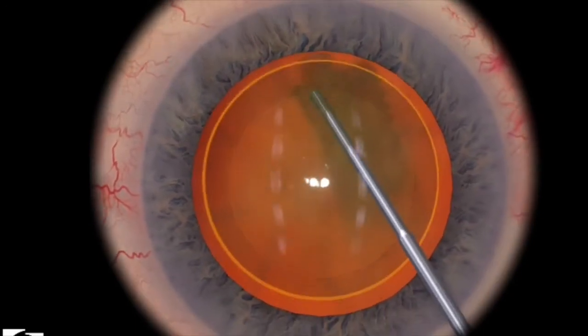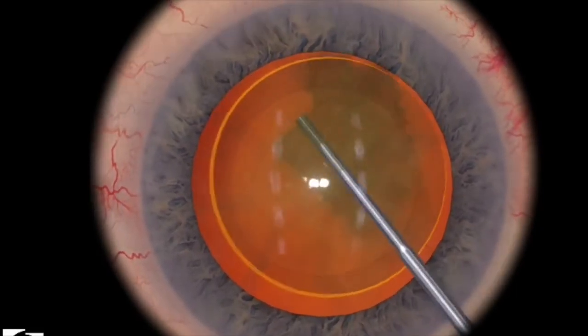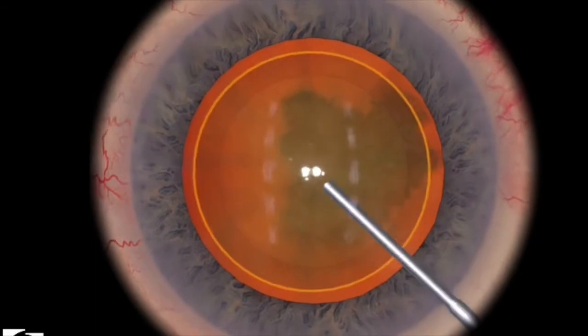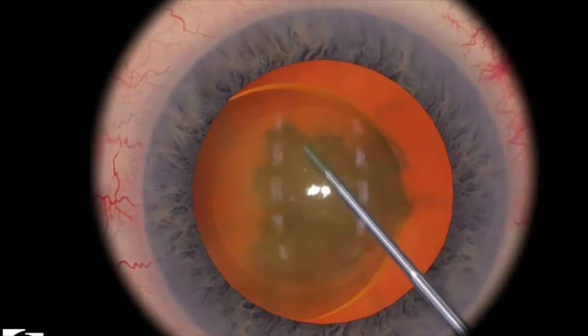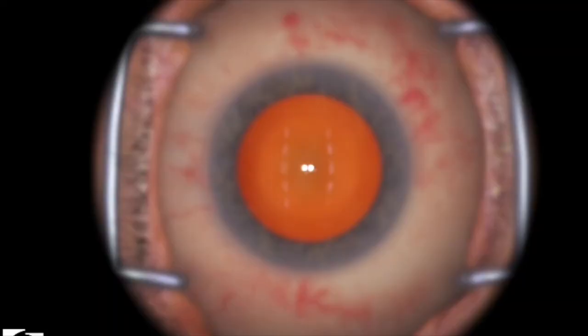Next I'm going to hydro delineate, and you have to hydro delineate enough, otherwise the machine won't give you enough points. Notice how I'm moving it around — the machine actually wants you to move it around to test and see if you've been able to delineate and dissect appropriately. When I'm moving around, you can tell that there's a little bit of space, like a gap, in between the golden ring and the nucleus. So I scored 95 and 100 respectively.